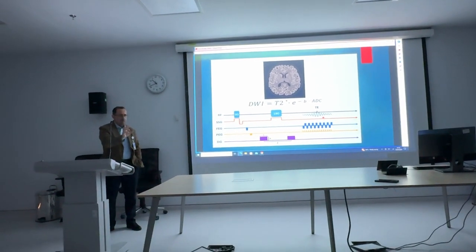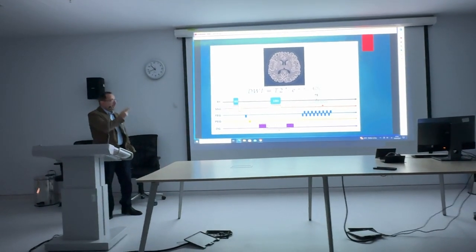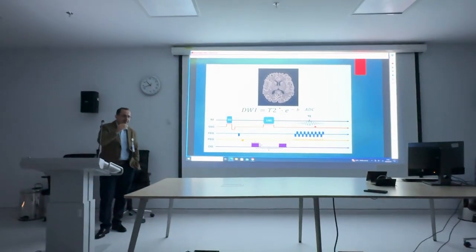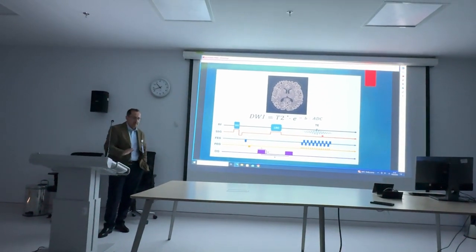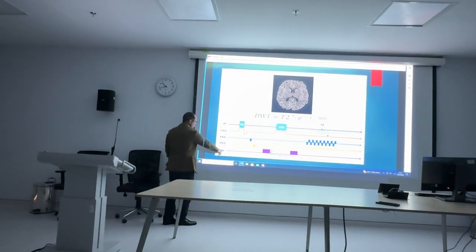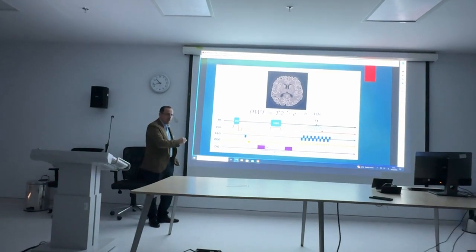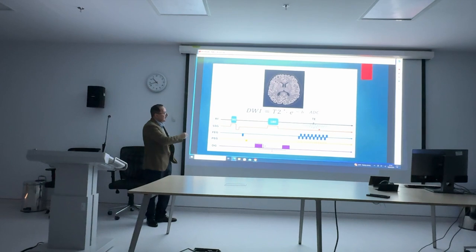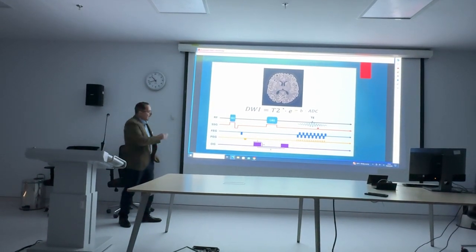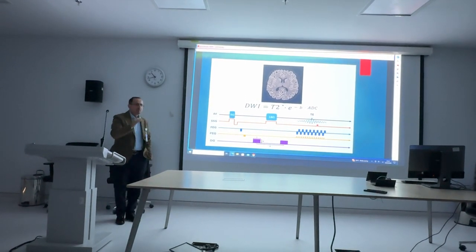So the aim of our application of a very strong gradient in this sequence, which we call the diffusion imaging sequence, is to get a dark signal by rapid dephasing. So you notice we add a new gradient, which is called the diffusion gradient, to our initial sequence, which makes the T2 star, which is called the B0. This type of diffusion gradient is a highly potent gradient.